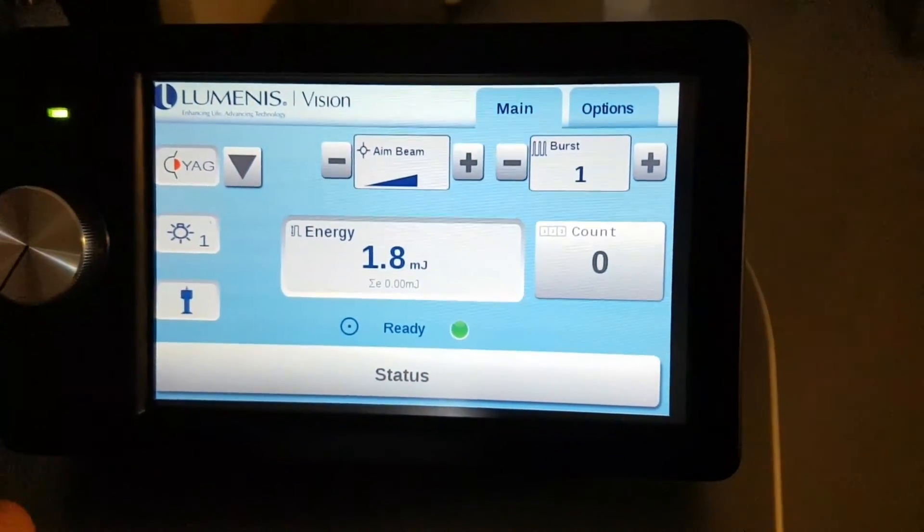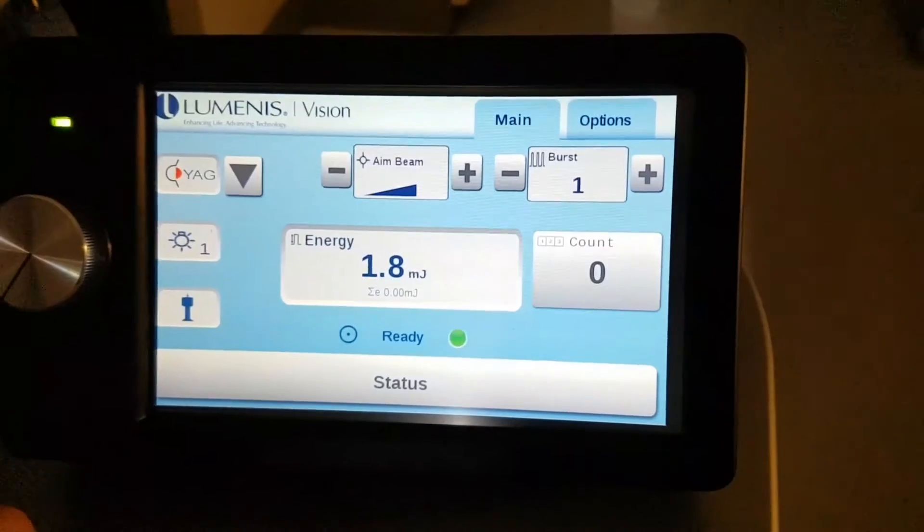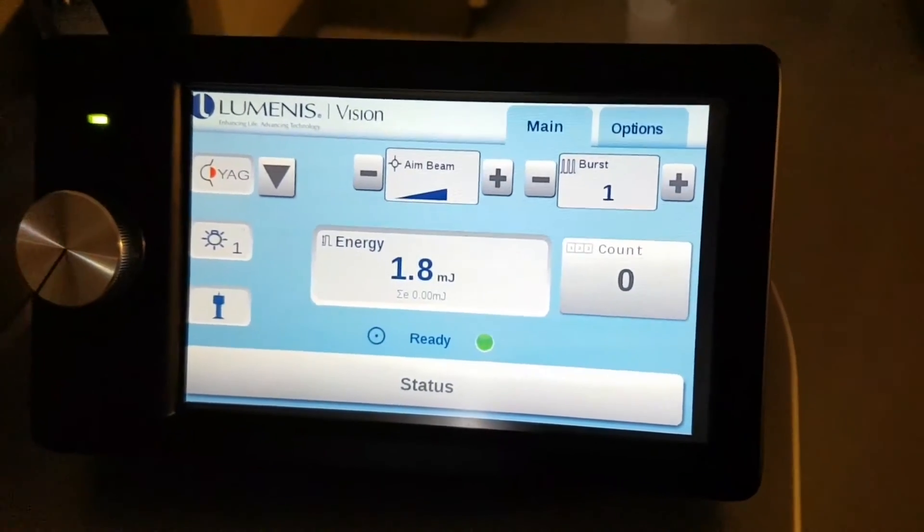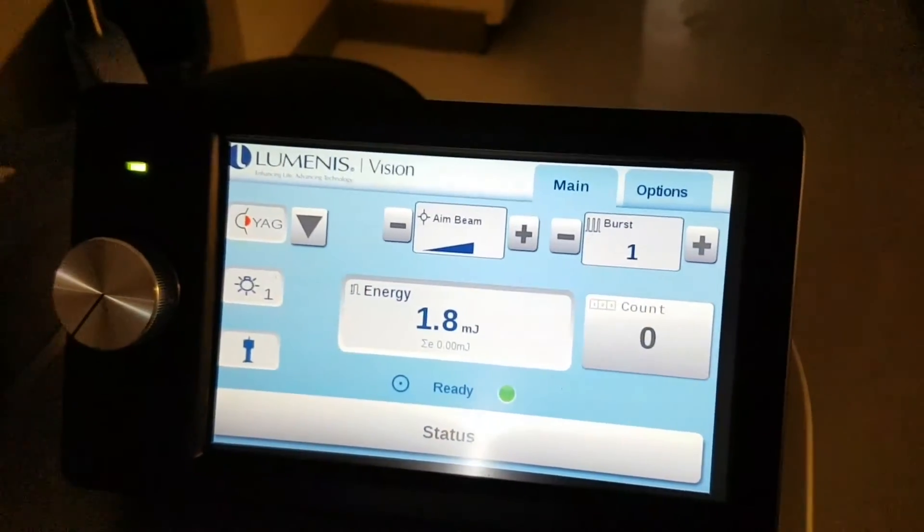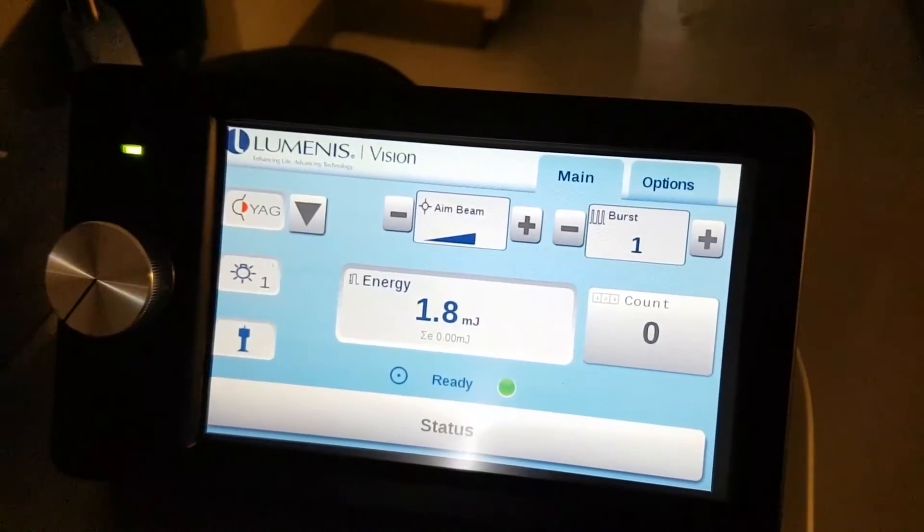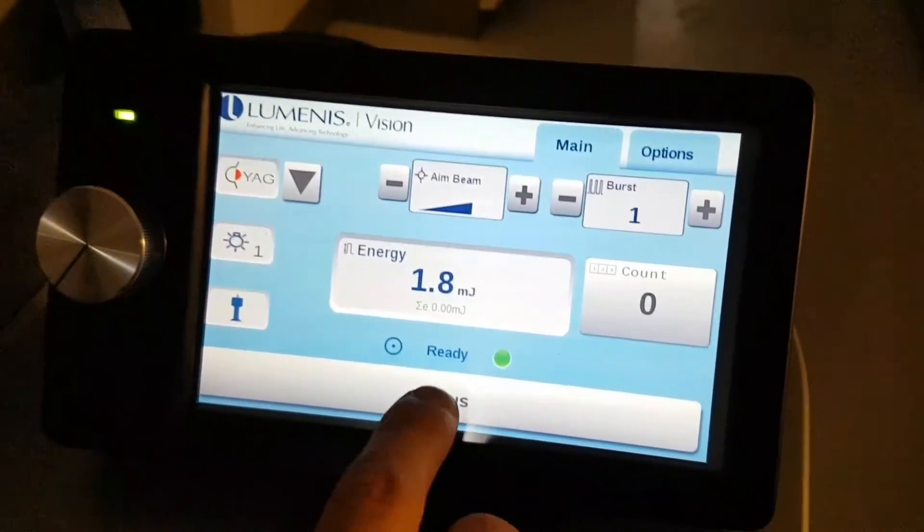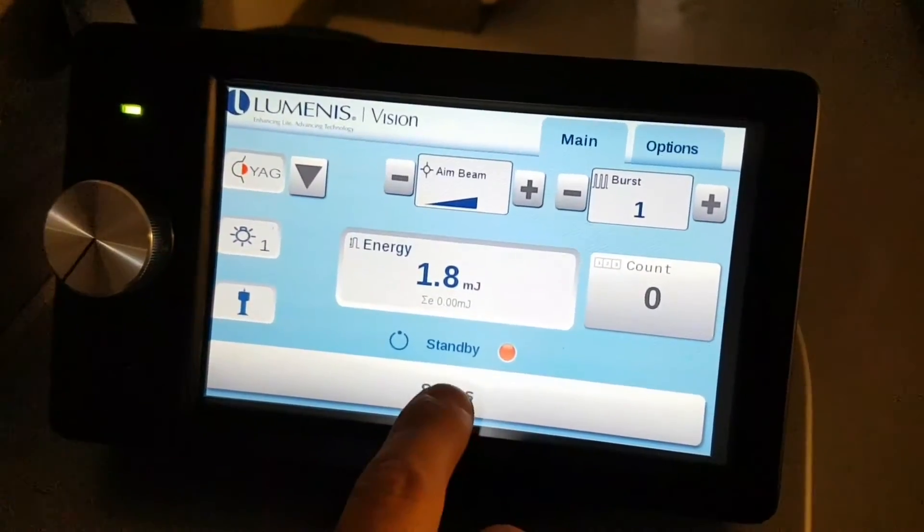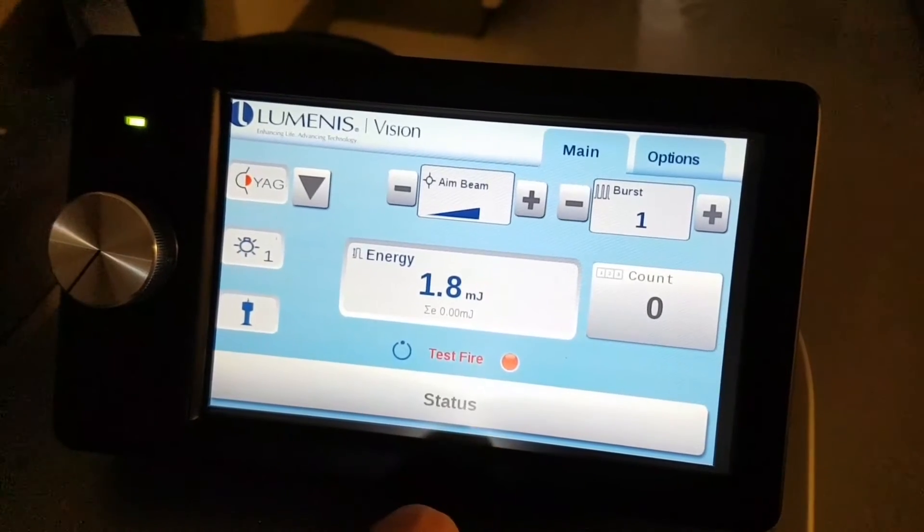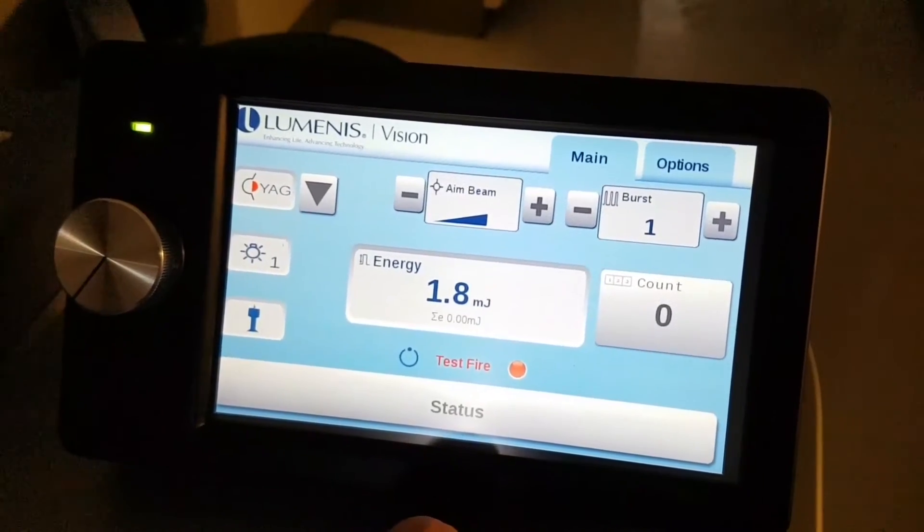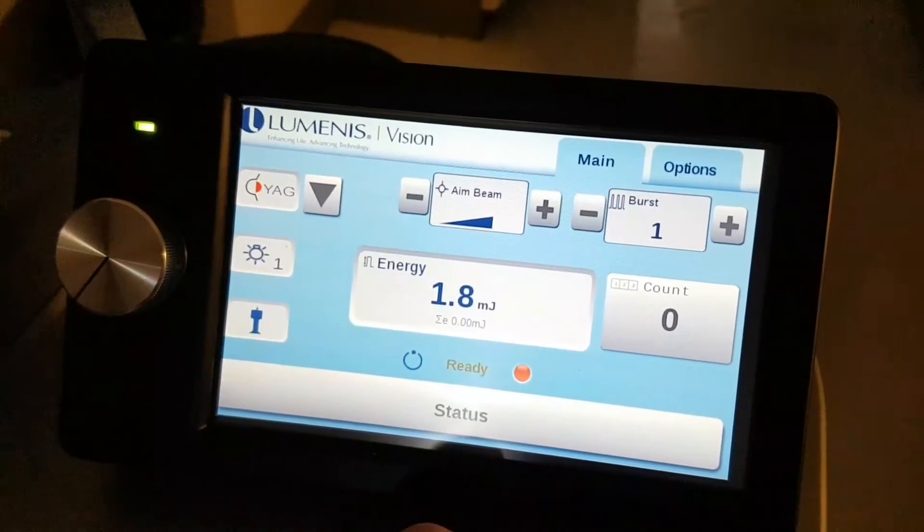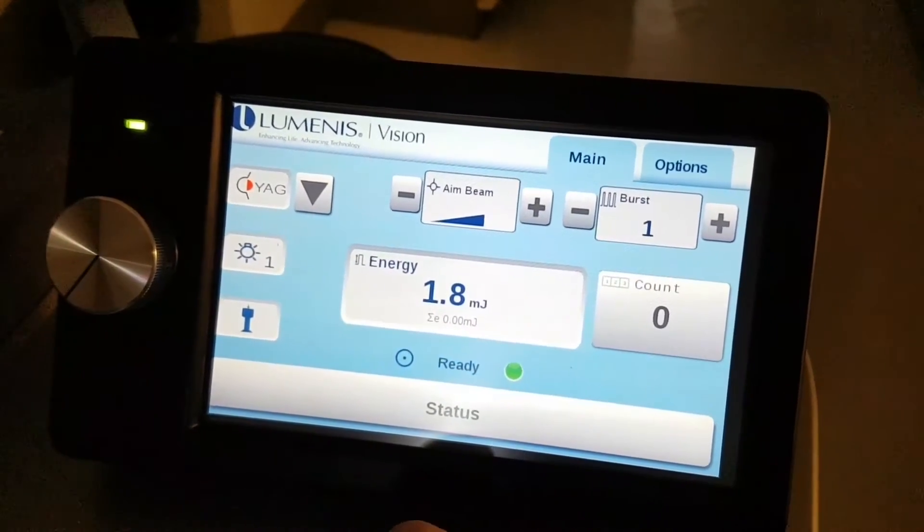Once you've moved it and the message disappears, just hit the status button and you'll be ready to fire.